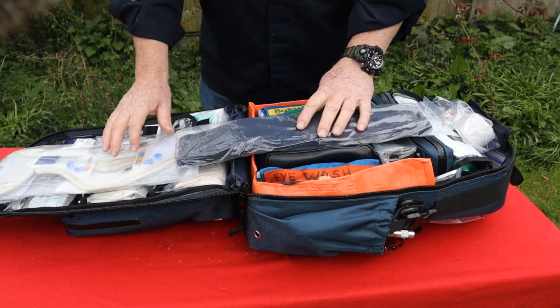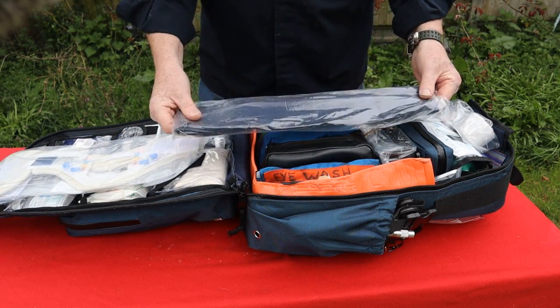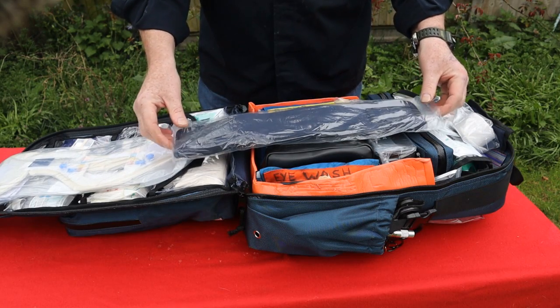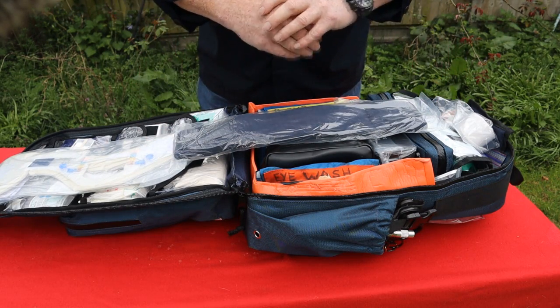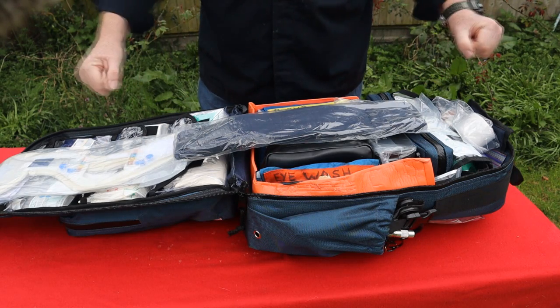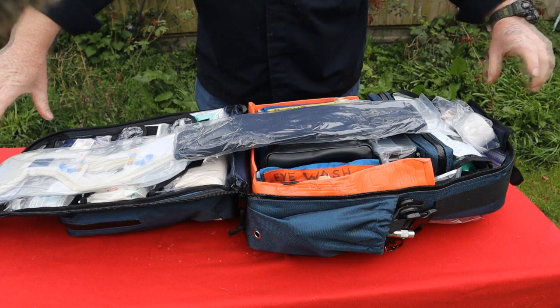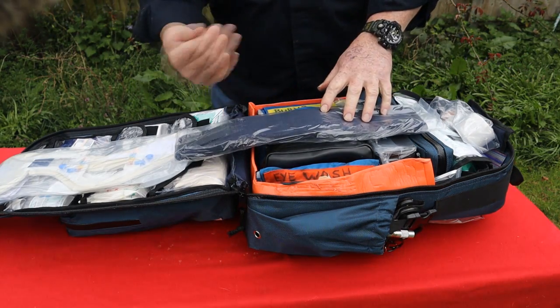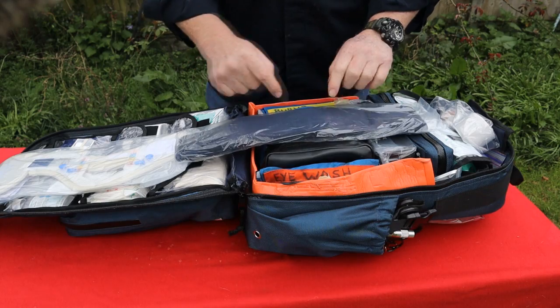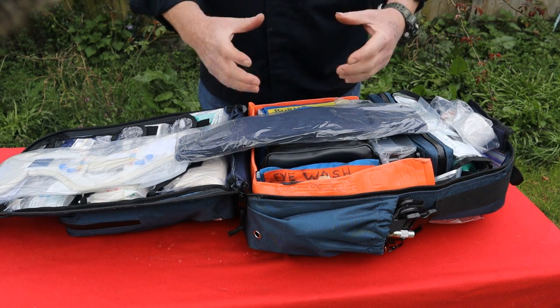What you can do with a soft collar is you can upgrade it. So what I've done in the past, I've put someone in a soft collar because that's all I had, and then I took a medium-sized towel, soaked it in water, wrung it out as best I could so it was as dry as possible, folded it up into a long strip, and then I put that over the top of the soft collar. That gave the patient a lot more cervical spinal support.